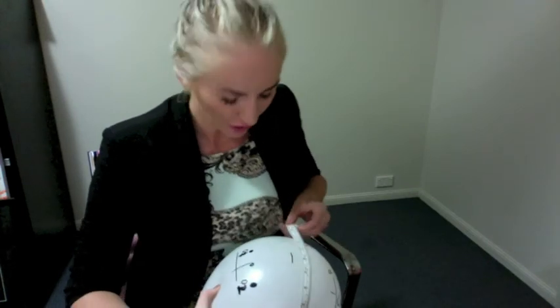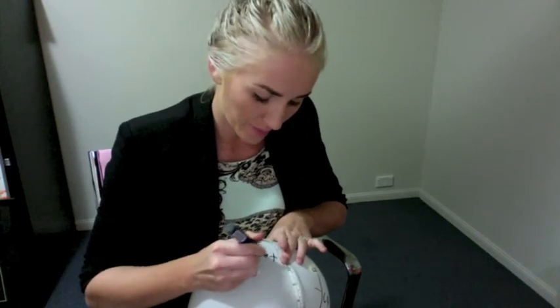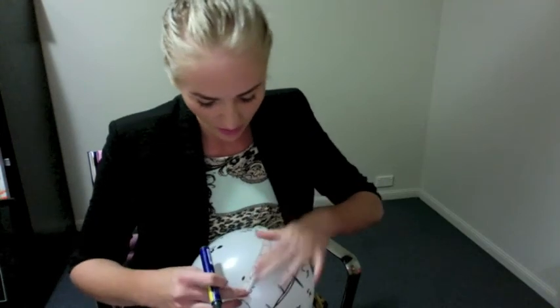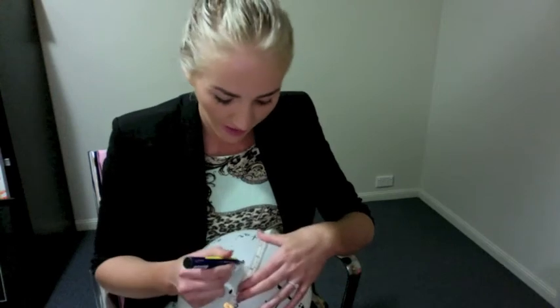So you go 50%, that gives you your PZ, and then 25% like we did in the frontal square, and that will give you P3 and P4.